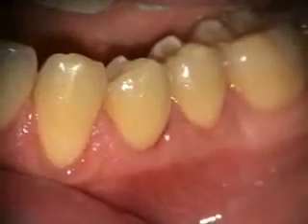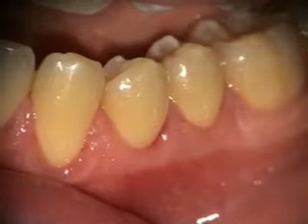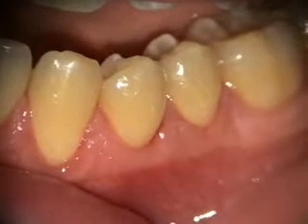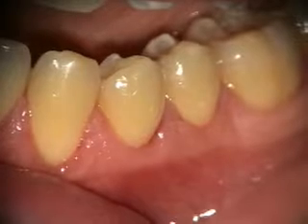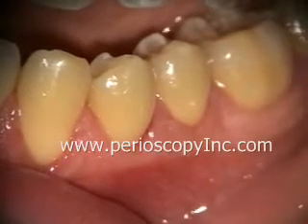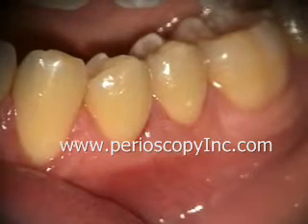This is a four-month healing of the alloderm graft on number 21. He got really good root coverage. The tissue is thicker now and has a little marginal inflammation, but I've asked him not to brush directly into the gum line. He had his teeth cleaned today. He had some pocketing on the distal of 18 — it was an eight — we scoped that, put some Arestin in there, and now it's probing a five.